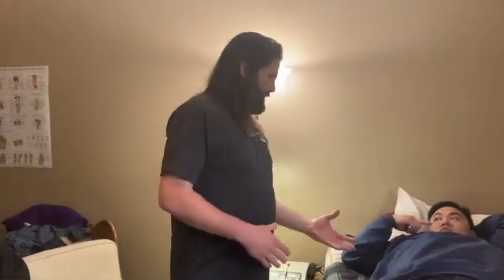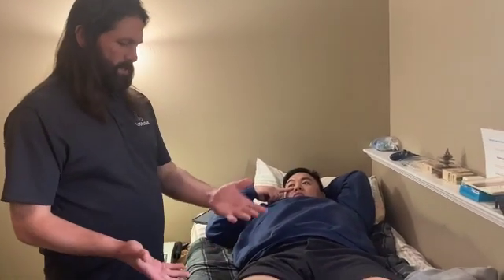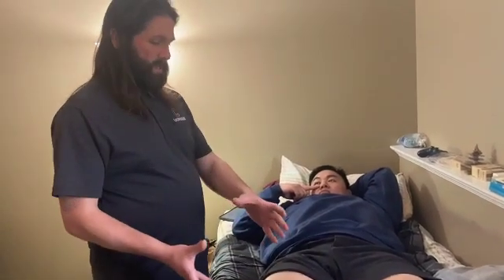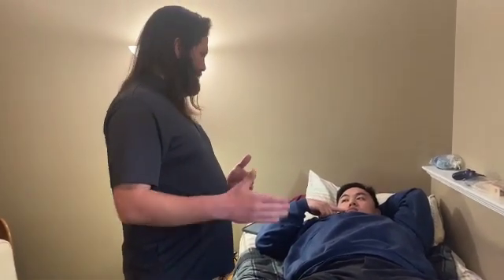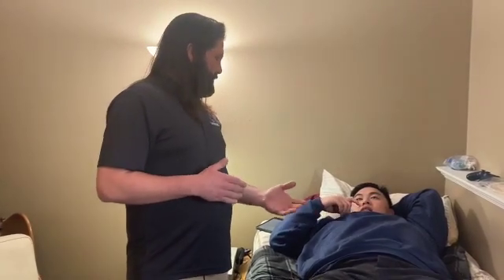So, Kevin, the point of this treatment is to utilize the gating theory through stimulation of the alpha beta fibers. So essentially, you're going to feel like a tingling sensation at your knee, and it's going to help take your pain down. Your chart says that you're at a 5 to a 10 for your pain. We're going to hope that this brings your pain levels down. So what would you say your pain level is at right now? 5 out of 10. 5 out of 10? Okay, so hopefully by the end of the treatment, we have you reporting a lower score.